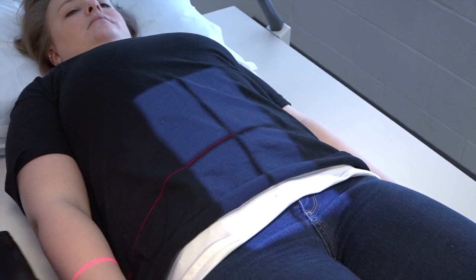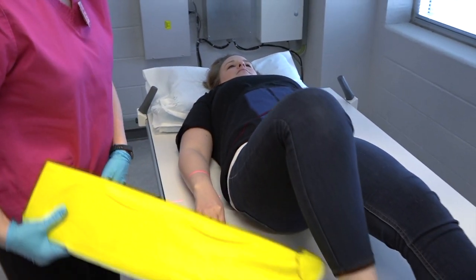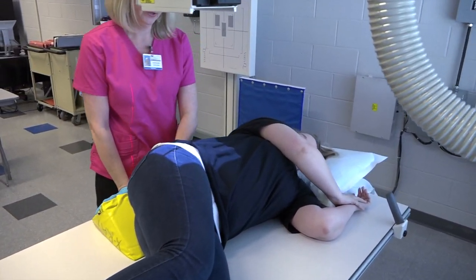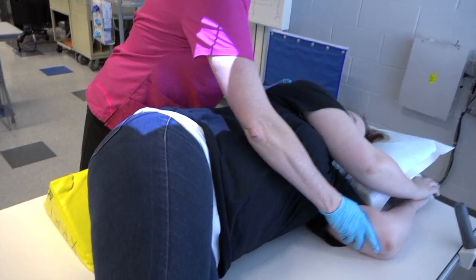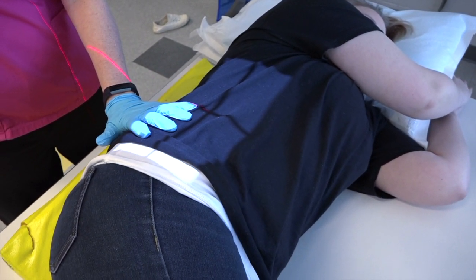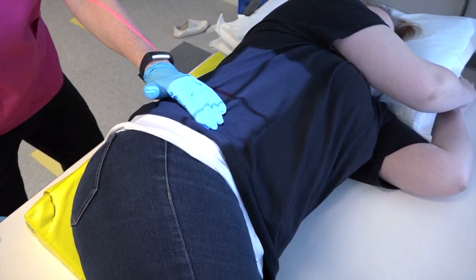Okay, now we'll switch to the obliques. If you'll ask the patient to roll on their left side. And then we're going to roll back. There we go. I'm just going to position the patient. Just position them the way that you need them to be. So we're going to go 1.5 inches above the crest, 2 inches medial from the ASIS.